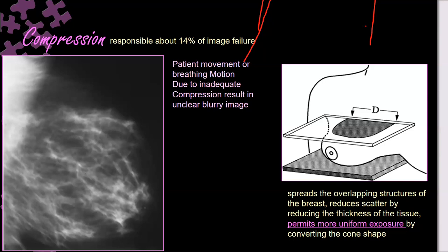Compression again. What about this image? If you look here, there is blurring or motion artifact also related to compression. So compression, compression, compression, positioning. What are the values of compression?